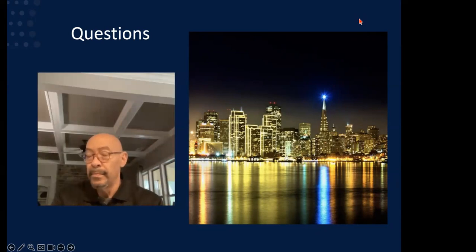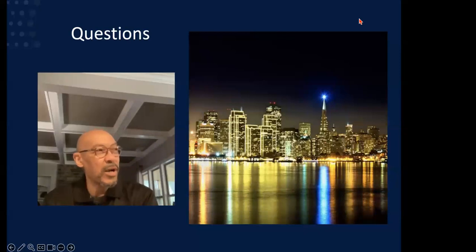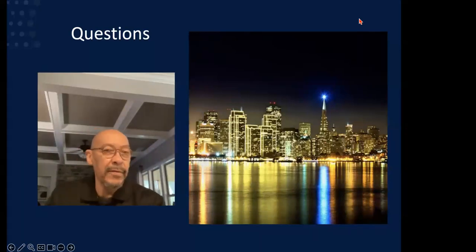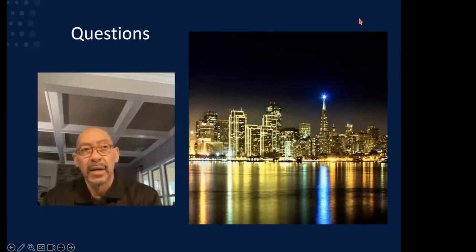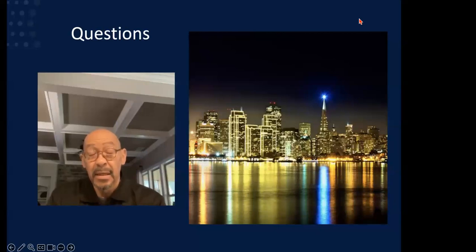Another question here. This one's from Ron. Will a UV filter be added to a later version of the lens? Absolutely. Ron, good question. We won't come to market without UV protection. In fact, we'll have two versions of it. So we'll have a UV version and a non-UV version. So we are looking at the types of chromophores that we can design into the commercially available lens. So we will have both UV and non-UV versions of the lens.